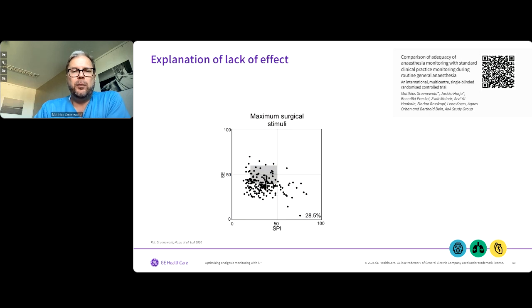However, when we looked at our data, we again found that we were not exactly in the target range. We were too slow in adopting our anesthetics to be in the target range, which was a protocol issue introduced because we looked at the pharmacokinetic models calculating the effect site concentration, and were only allowed to change again after reaching those effect site concentrations.